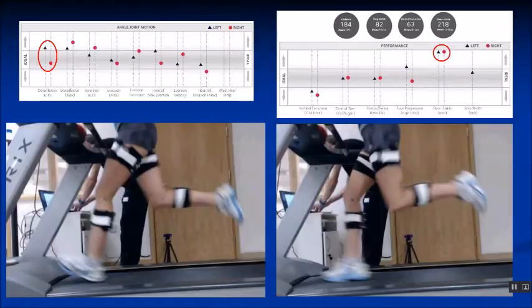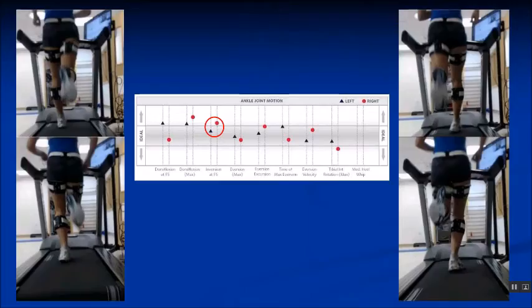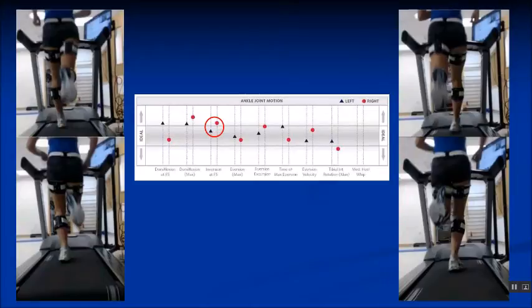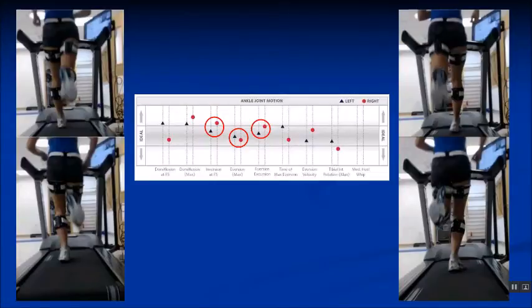Of note is that there's an overstride bilaterally despite having a relatively high cadence. When we look at the rear foot — and please note that we are taking measures from the shoe, not the foot within the shoe — there is a degree of inversion at foot strike, more so on the right. The actual position achieved is within the normal range, but we have a relatively high excursion on the right side, even though velocity is within the normal range but again slightly higher on the right.